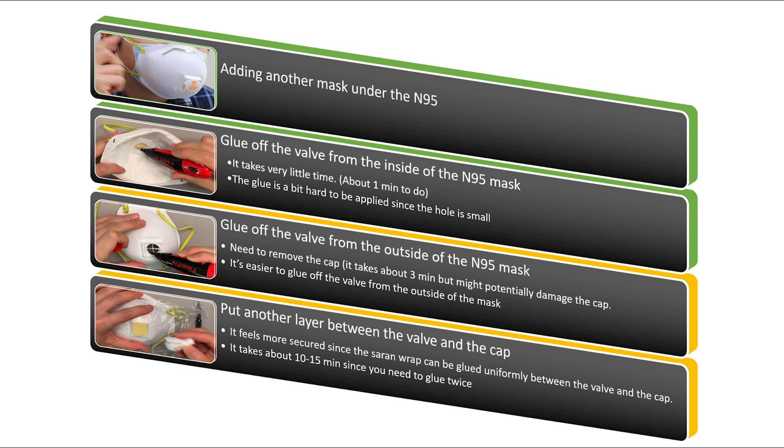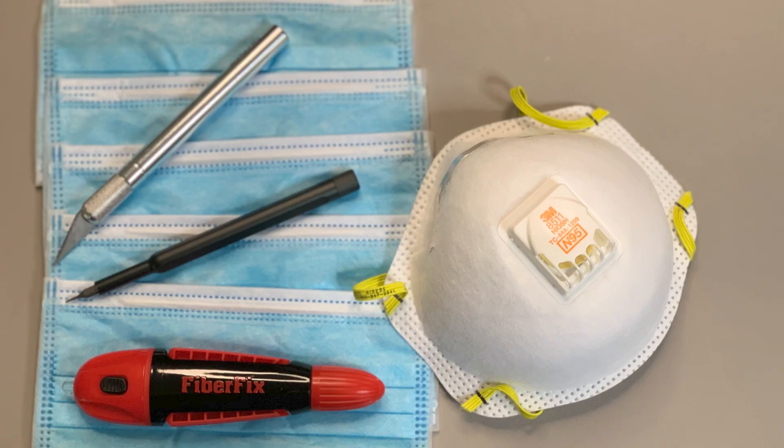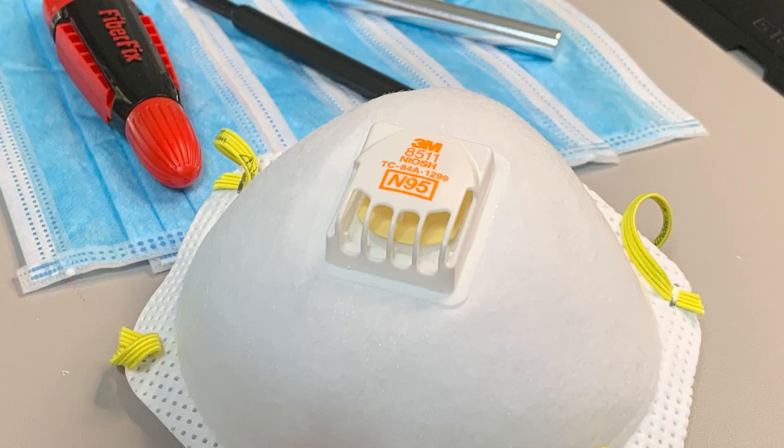Let's summarize the four different methods. The top two — adding another mask and gluing the valve from the inside — require very little effort. However, for the first method, wearing two masks is actually kind of hard to breathe. For the third and fourth methods, even though you need to take off the cap, the way you secure the valve and seal it with saran wrap feels more secure and waterproof, though they require some tools and additional time. In conclusion, the first method is the easiest, and methods two through four are easier to breathe with, even if they take more time. I've tried all four methods over the past two months and this is what I found.